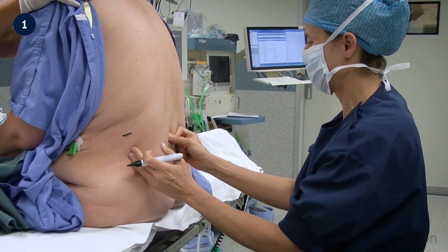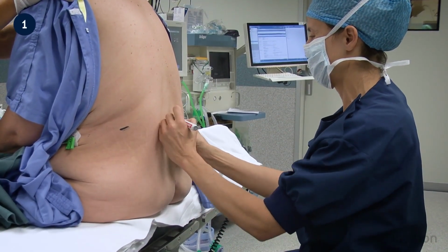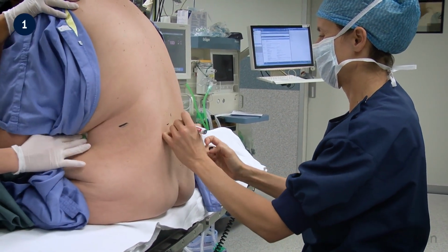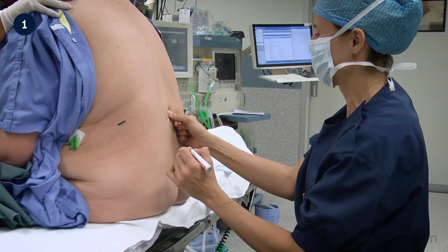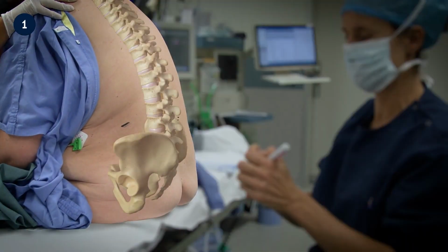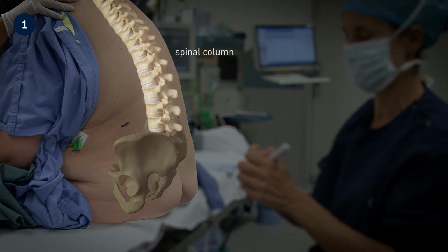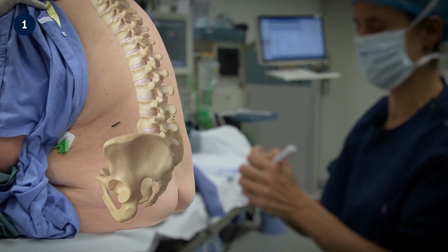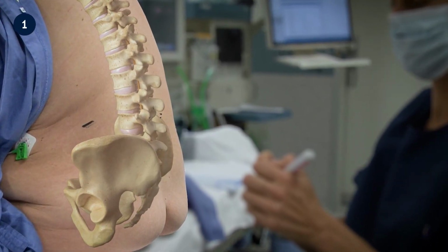Anatomical landmarks seen being marked on the skin now are used to guide the advancement of the spinal needle into the subarachnoid space at the level of the lumbar spine. With the aid of an inlay, some anatomical structures will now be identified. The spinal column and its relation to the bony pelvis is now shown. Take note of spinous processes of the lumbar vertebra.